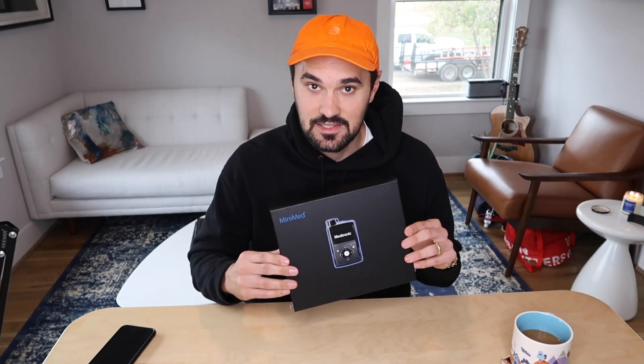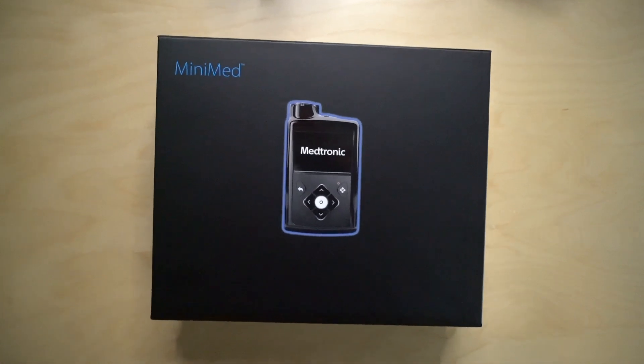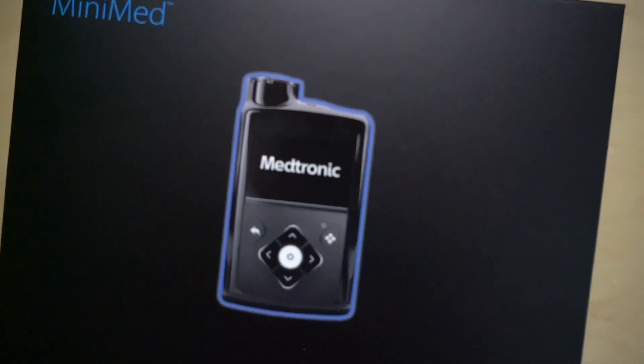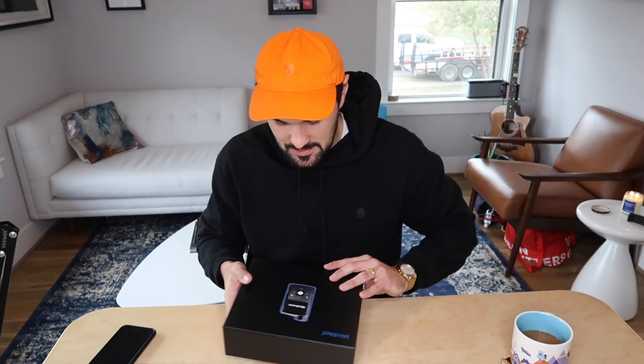Let's do the actual unboxing. Here's the box — look at this pretty cool packaging. It's super slick. It's got the magnets here and the pump is surrounded in all its glory right there, surrounded by blue light. Pretty cool. It's even a little bit sexy, which is definitely not something you think about with diabetes packaging. But this feels like an Apple product. It feels like a Bose or a Sony product. It's just really nice, upgraded packaging.